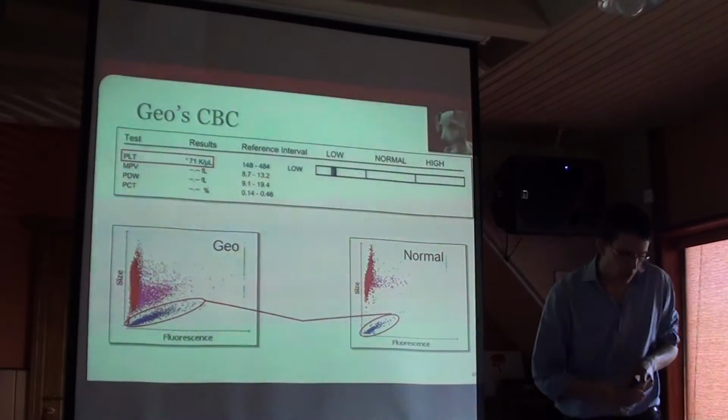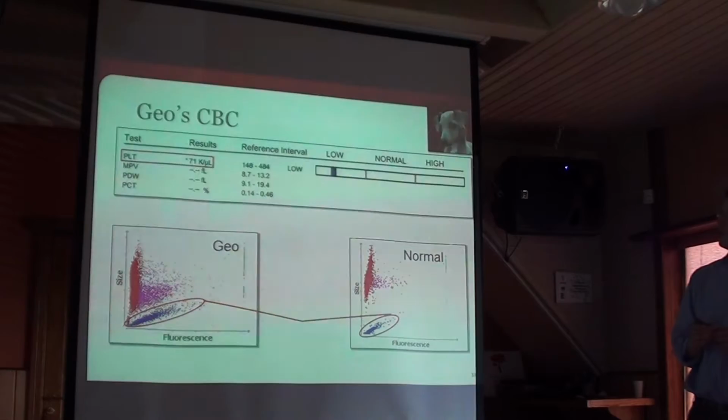But I want you to look at another feature on this report, which is the platelet concentration.